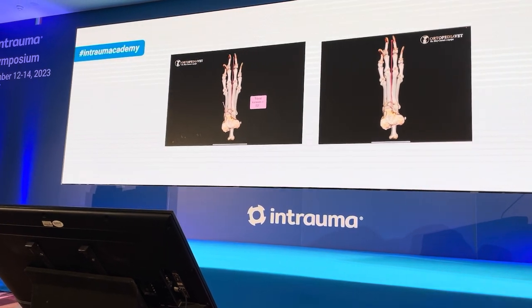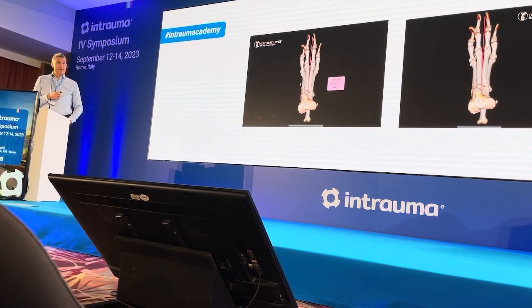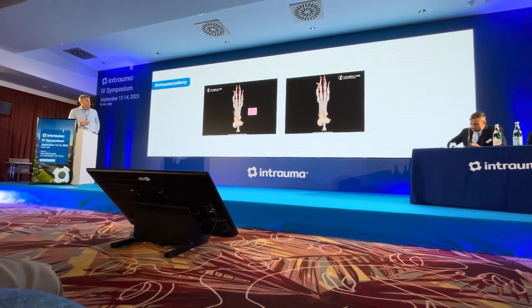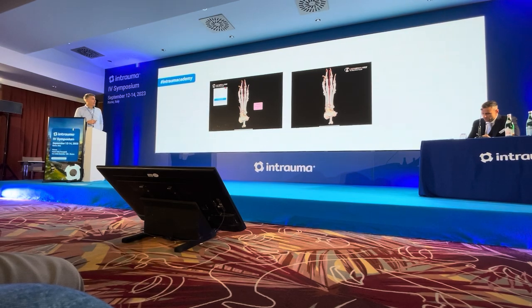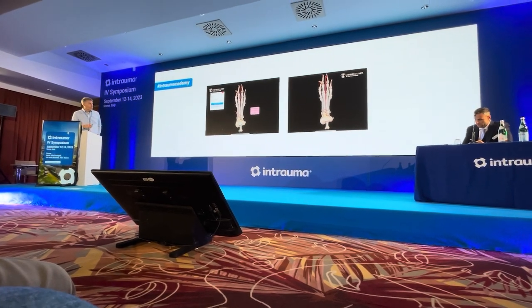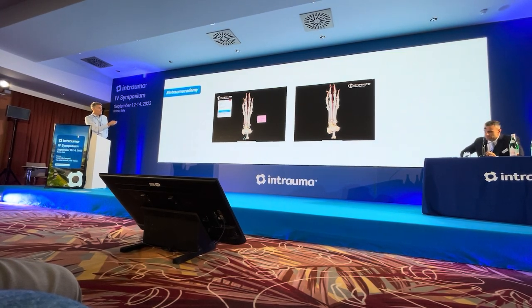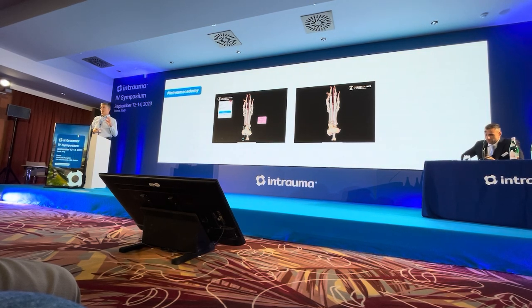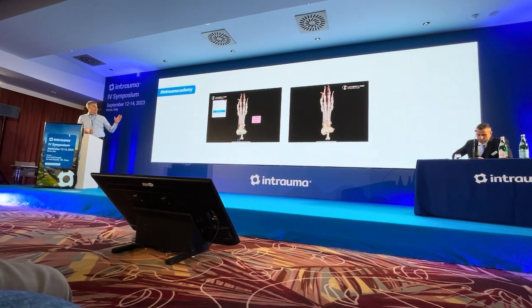These video illustrations illustrate a couple important points. The video on the left is obviously a CT axial view of a tibia with 22 degrees of external tibial torsion that was contributing to medial patellar luxation. And there are a couple of important points. One is the tibial plateau has a pink line, and as you see, this illustration represents a derotational osteotomy, similar to a proximal tibial osteotomy. And so in correcting the deformity, the tibial plateau is moving with the tuberosity.